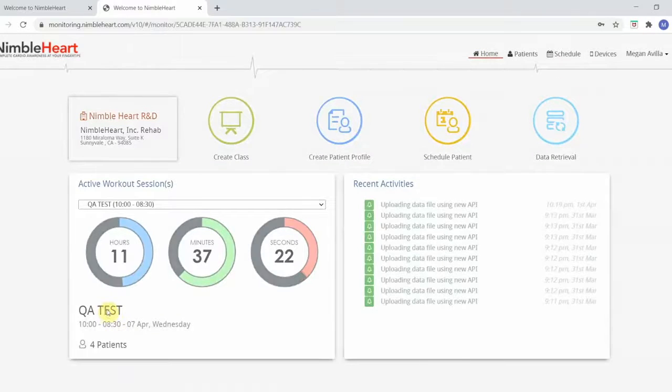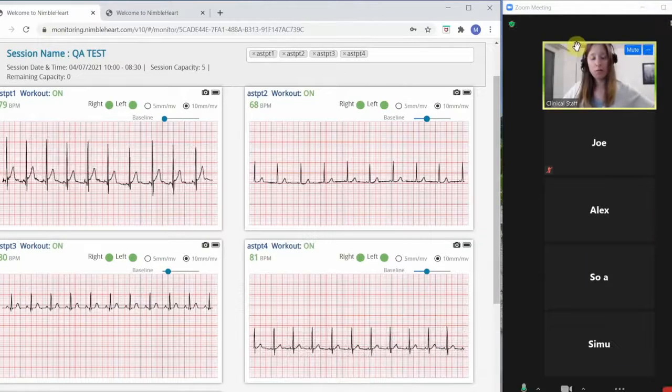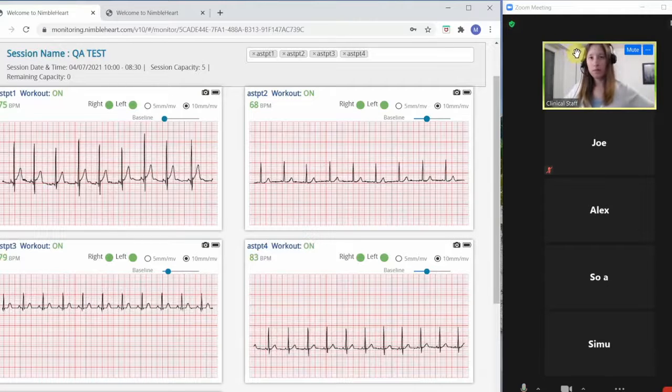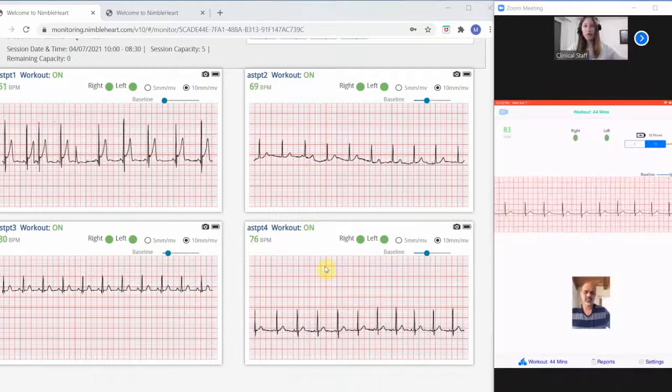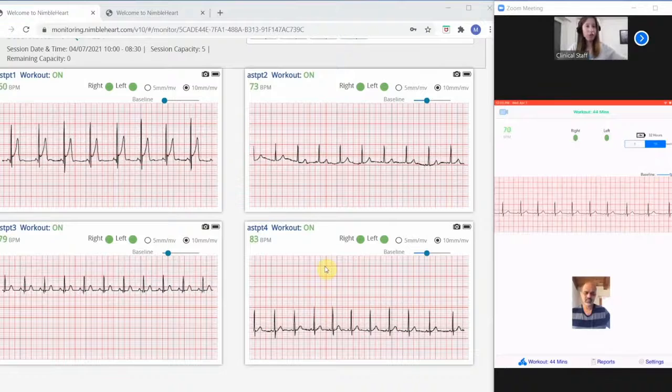Once the class starts, you can watch each patient's ECG and communicate with them on your favorite video conferencing platform. You can even talk to a patient privately while keeping an eye on the other patients' ECGs.